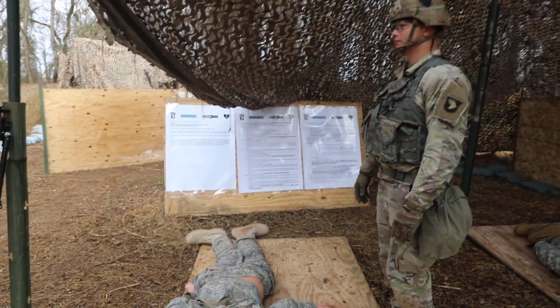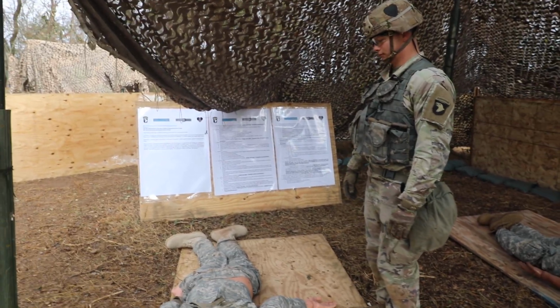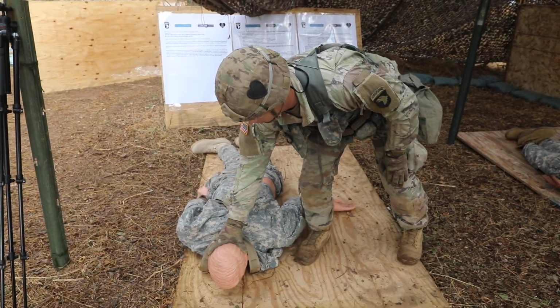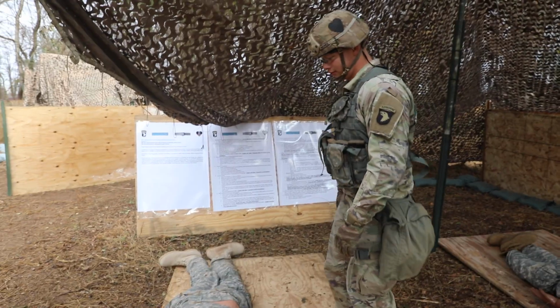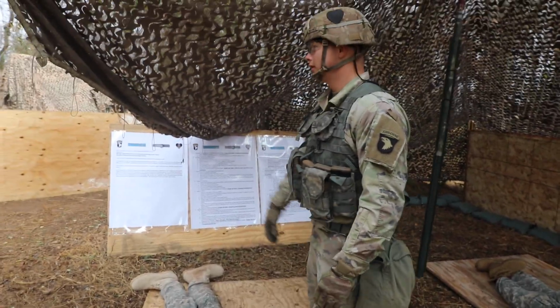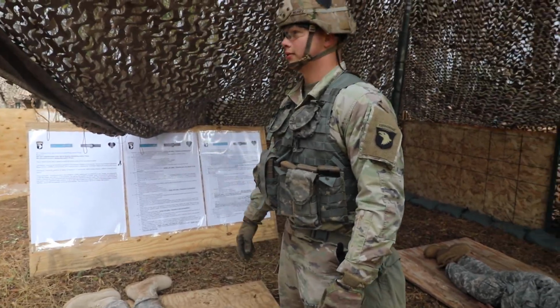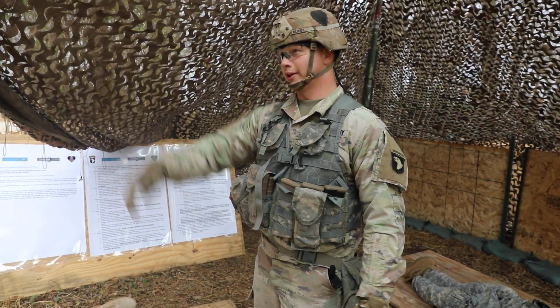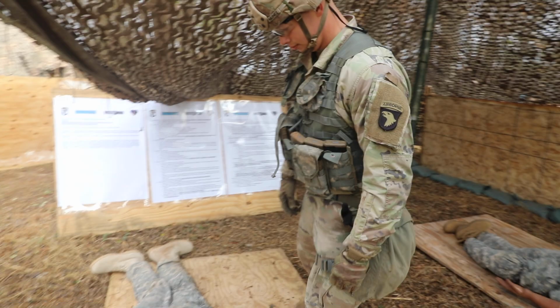Task: perform first aid to restore breathing and/or pulse. Step 1, approach the casualty and check for responsiveness. Hey, are you okay? Casualty is unresponsive. Direct a specific bystander to call for medical personnel. Get medical personnel. Direct another specific bystander to retrieve an automated external defibrillator. Get a defibrillator. Step 2, roll the casualty onto his or her back.